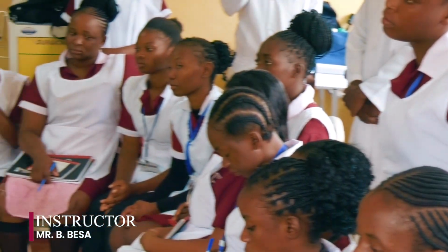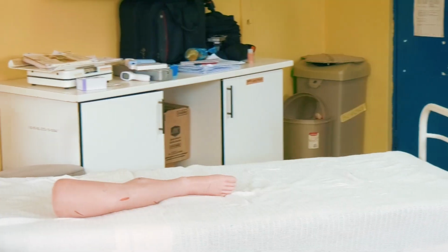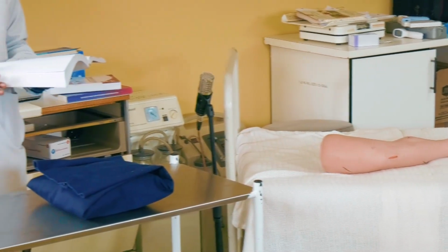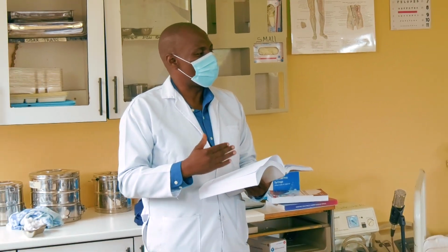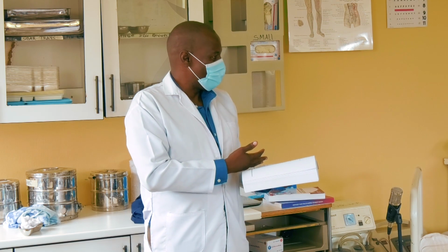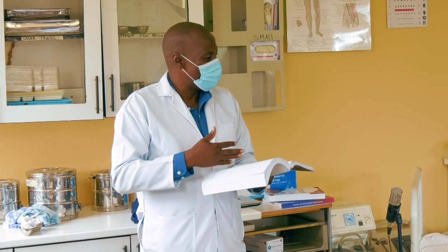Wound infection is important, these are sterile procedures. There is no need for us to start complaining that sterile procedures are like this. In fact, what you are learning now should be in your blood. If you touch anything that is not sterile, you can always correct it. If you are wearing sterile gloves, remove them and wear another pair. Because we don't want the patient that we are dealing with now to come back with an infected wound.